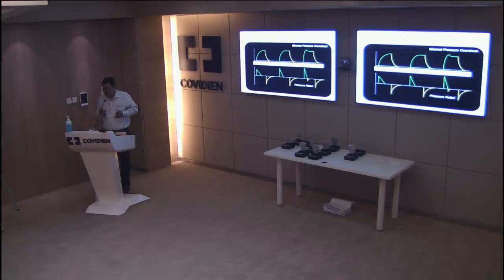These are subtle things that might help you to make the patient comfortable. Otherwise, if the patient is not comfortable, everybody sedates, paralyzes. That's an idiot's way of ventilating. Anybody can do that. That's what we tend to do. Patient not comfortable, sedate, paralyze. But you should use your mind, try and adjust your settings to make the patient comfortable, try and minimize sedation, paralysis, etc. Otherwise there's no point. If you just paralyzed everybody, you wouldn't need this whole class. You can just paralyze and go to sleep.